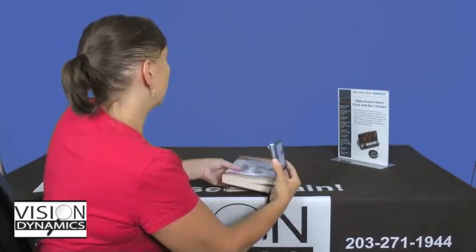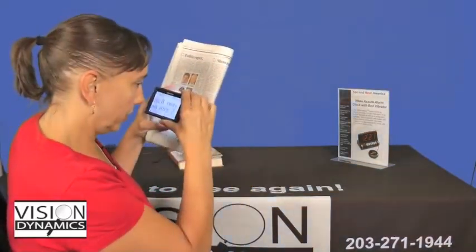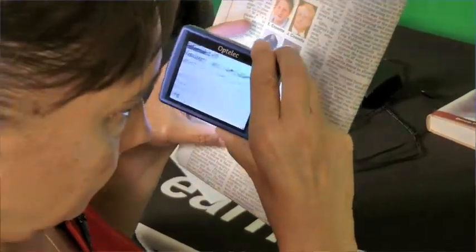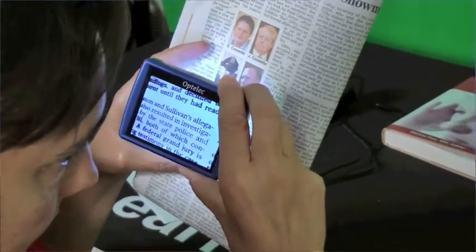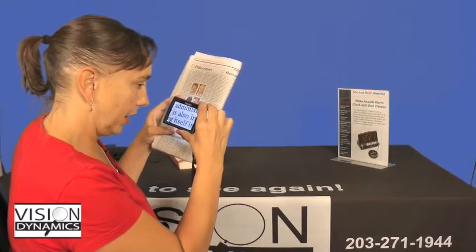Now, I'm going to take the stand and bring it in, and I'm going to show how you'll naturally learn the distance to keep it away from the paper. It'll come very naturally with practice. I can, just keeping it nice and flat, turn it on and bring it up to the newspaper. So if I want to read a recipe or a quick note about when the movie's playing at the movie theater, I can do that.